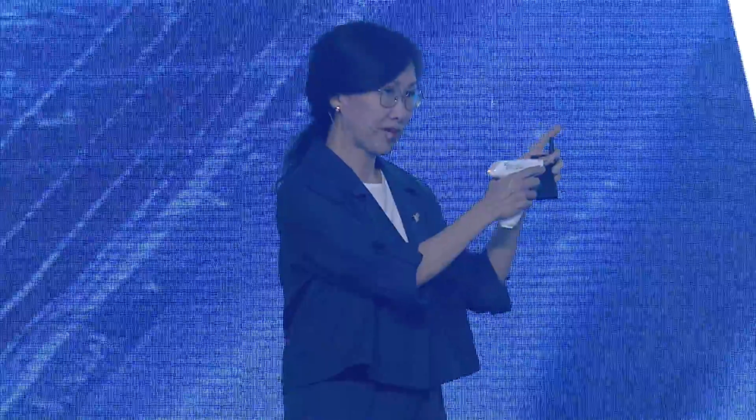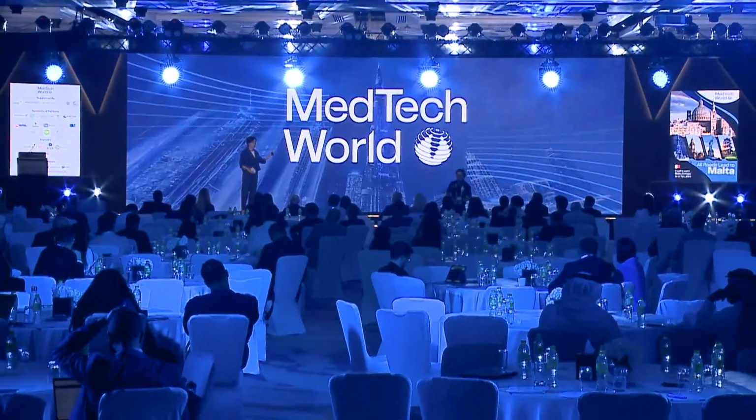When it's about 5 millimeters, all I do is press on this. I hold the device still. The last 5 millimeters, it advances itself, the shaft. Once it touches the eardrum, there's a touch sensor feedback, very fine feedback force to the device, which kicks off the software program in here that's been pre-programmed for different angles of eardrums, makes the cut, and inserts the tube in that 1 second that you saw.